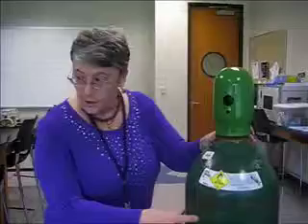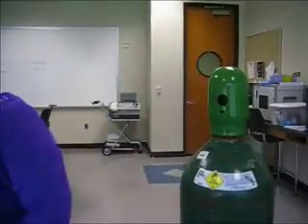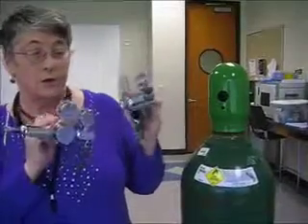I'm Kelly Busby, and we're going to talk about putting a regulator on an H cylinder. H cylinders are the big tanks, and how we remember this is H means huge. So I need a regulator, and I've got two choices of regulator. The one that I need to pick is going to be the one that fits this.